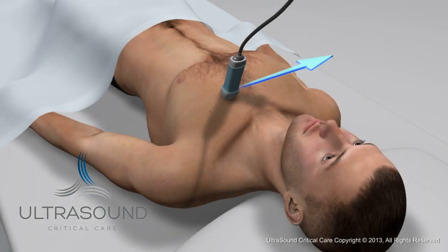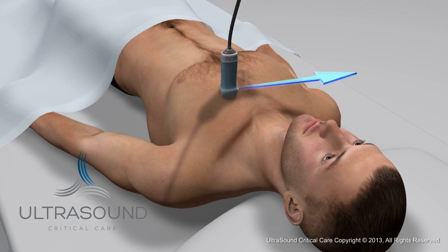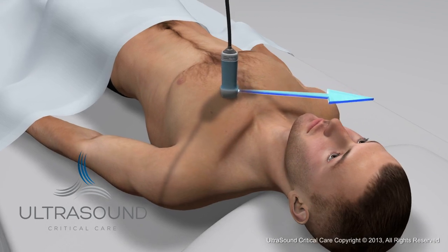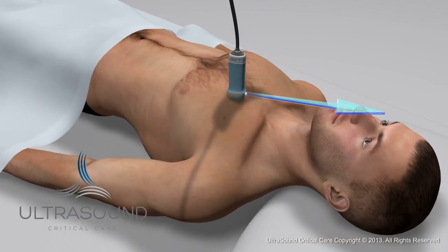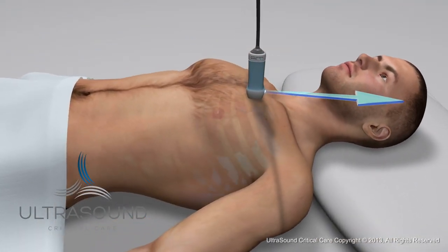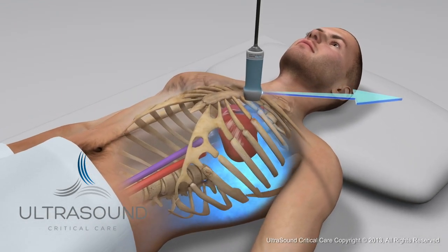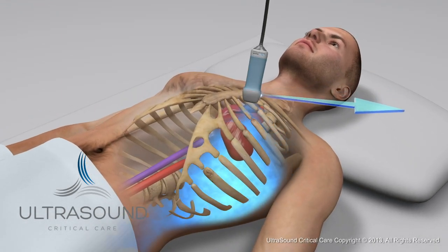Parasternal short axis view. Moving from the long axis positioning, you will now rotate your probe clockwise until the dot is directed towards the patient's left shoulder.